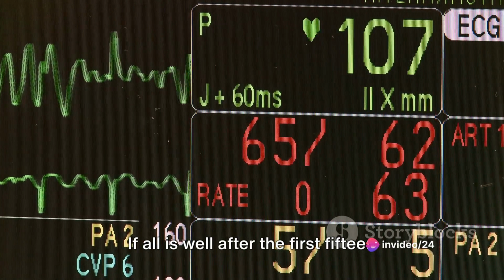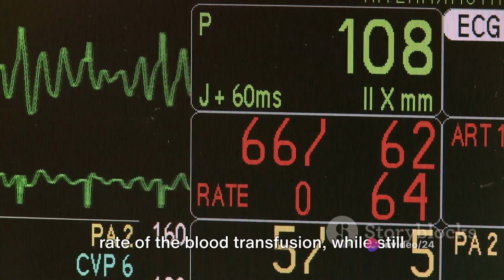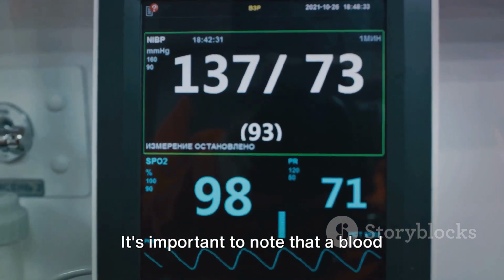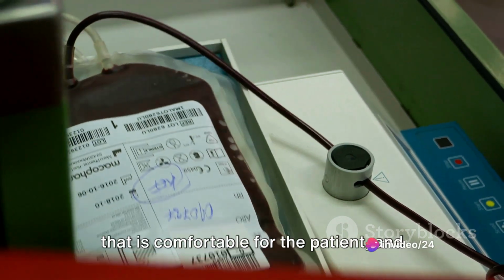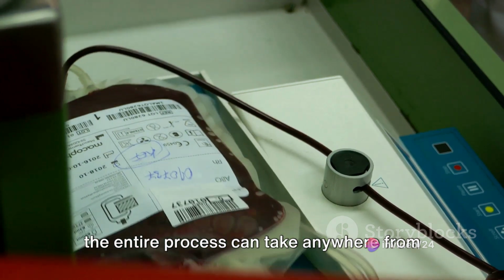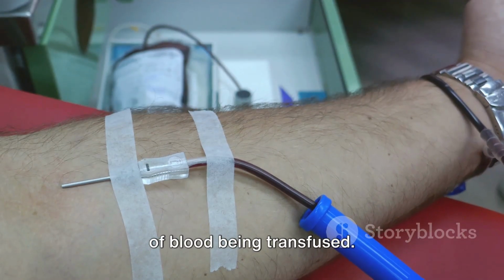If all is well after the first 15 minutes, we can gradually increase the rate of the blood transfusion while still monitoring the patient closely. It's important to note that a blood transfusion is not a race against time. The blood should be transfused at a rate that is comfortable for the patient, and the entire process can take anywhere from 1 to 4 hours, depending on the volume of blood being transfused.